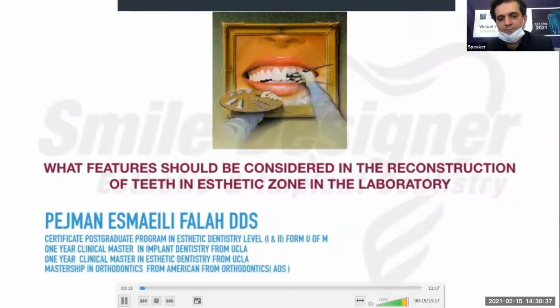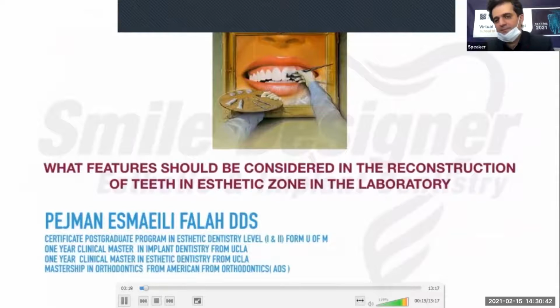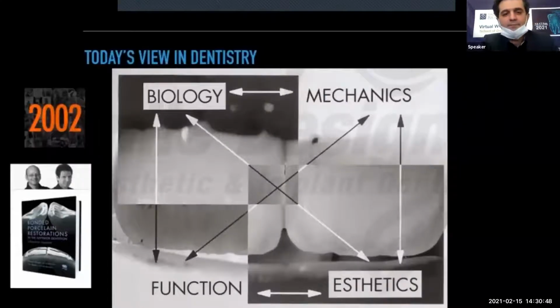The next presentation is about composite layering, art, and surface structure. Finally, I will present how to make a feldspathic laminate veneer.